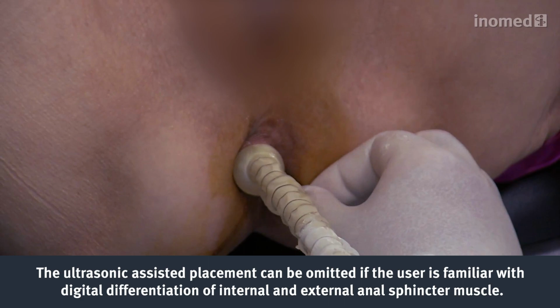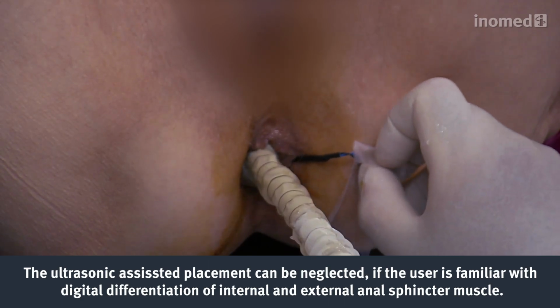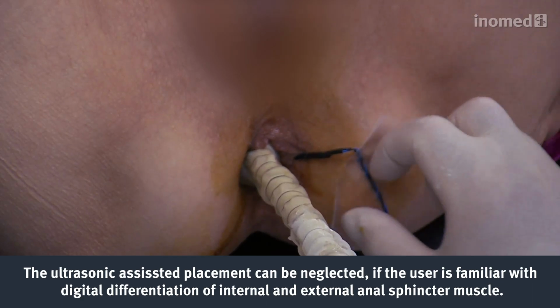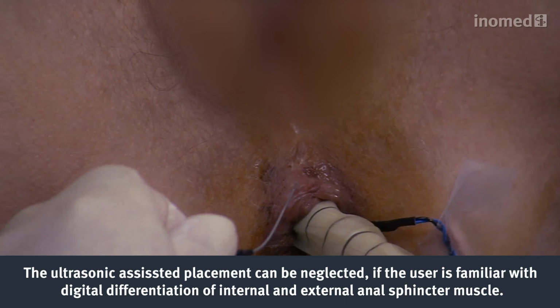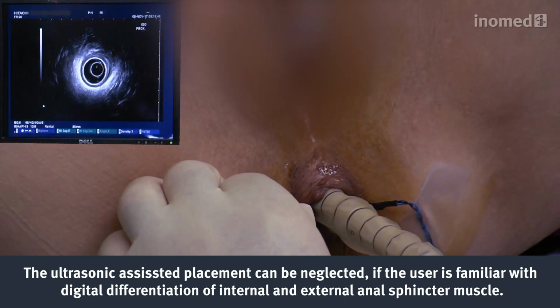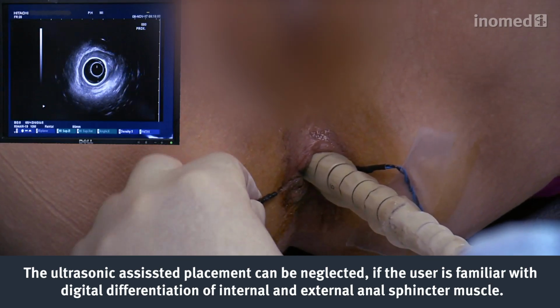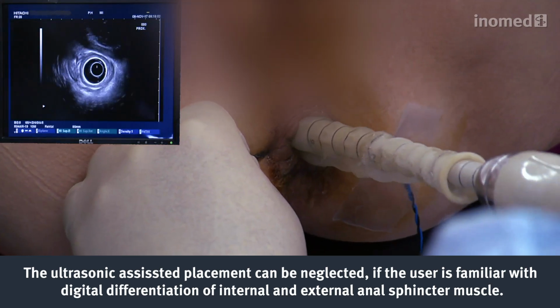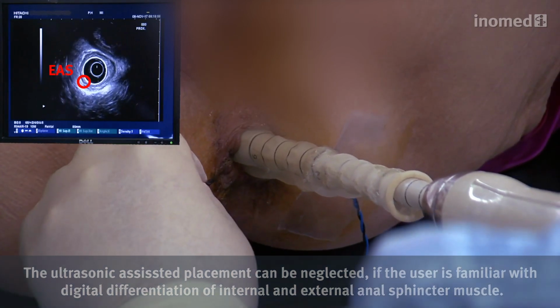After successful placement of the electrode, it has to be fixed adequately in order to prevent dislocation. Subsequently, the electrode can be connected to the adapter box. The second bipolar needle electrode is inserted into the external anal sphincter. The green ground electrode is inserted into the gluteal tissue beside.